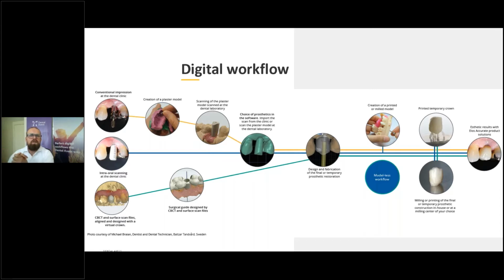Then we have the creation and we have the impression. We have the plaster model. On that plaster model, we're going to put the scan body. I'm going to talk a little bit later also about the scan body, what it is. We're going through it. Your design, you make a model, you make your final restoration. You can go intraoral scanning directly from the mouth with a scan body, design, making your models or the final restoration. Or we're going to do guided surgery, so it's already planned in advance.